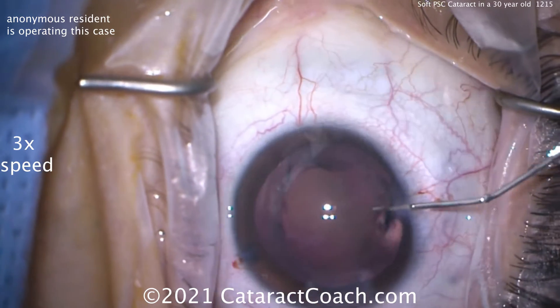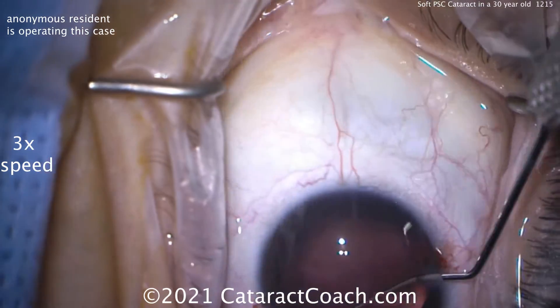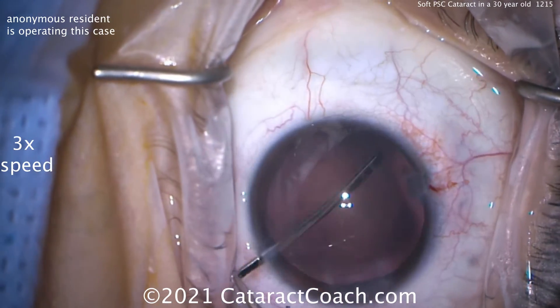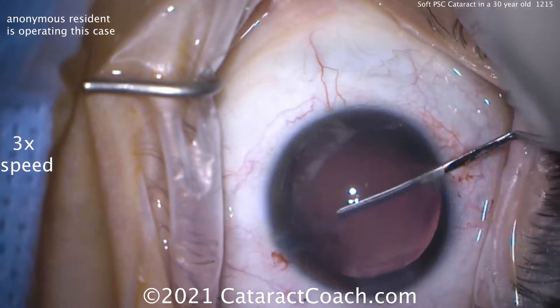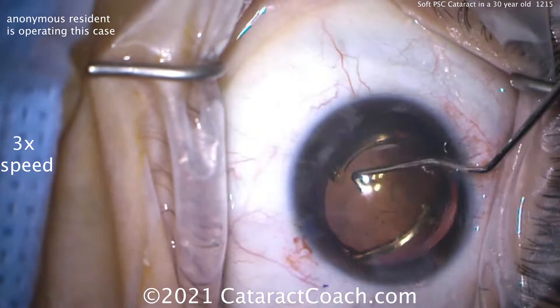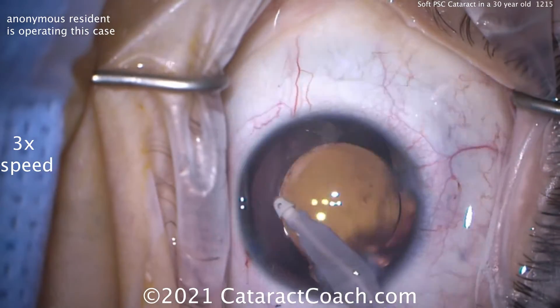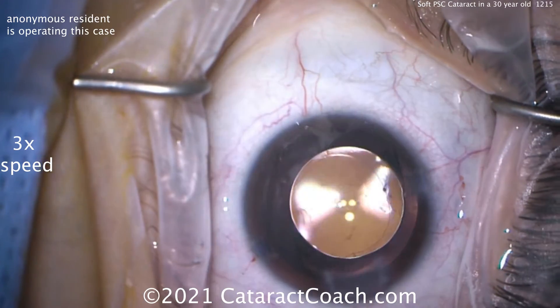Not letting the eye collapse — that's a good move. Filling it up. Now placing in the lens. The resident is going to load up the lens. In a case like this, we want to be extra cautious. I'm using the spatula to polish the undersurface of the anterior lens capsule, getting all that lens epithelial cell material off. Back to our thought about PVDs — there is no PVD in this patient because they're so young. The patient may develop a PVD post-op because we've replaced that thick 4mm human lens with a very thin, less than 1mm IOL. The vitreous can shift, so watch these patients carefully in the post-op period, especially if they're young myopes. You can see the lens capsule looks a lot cleaner after polishing the undersurface of that anterior capsular rim.